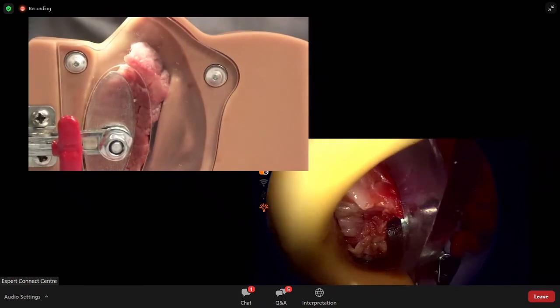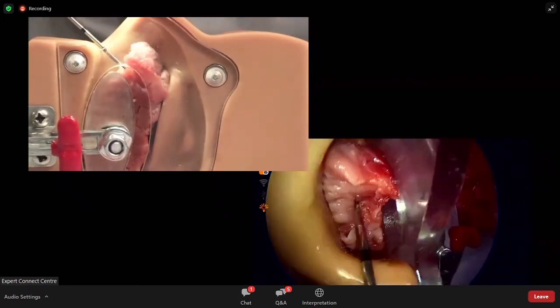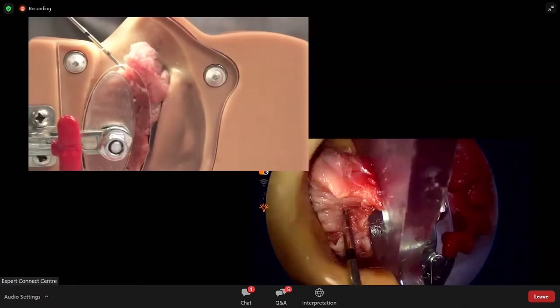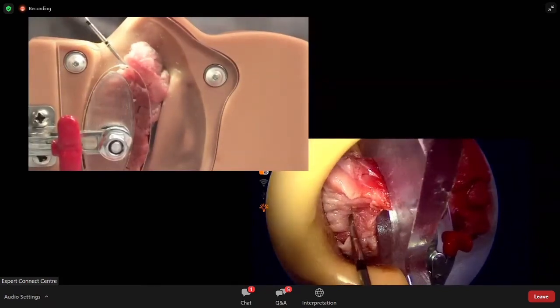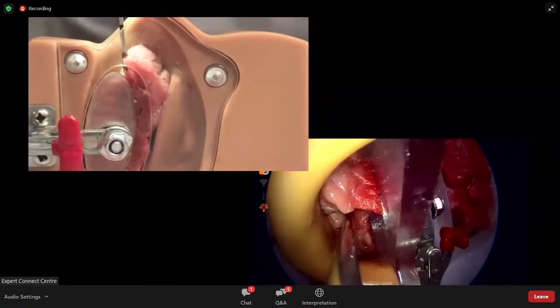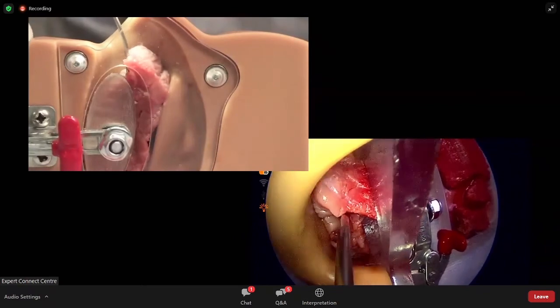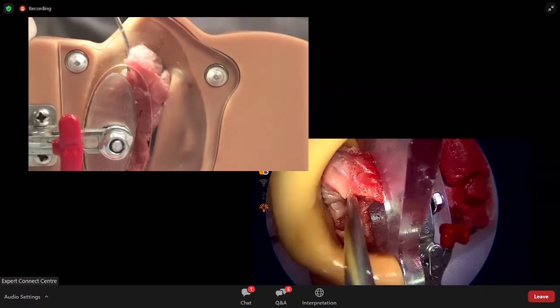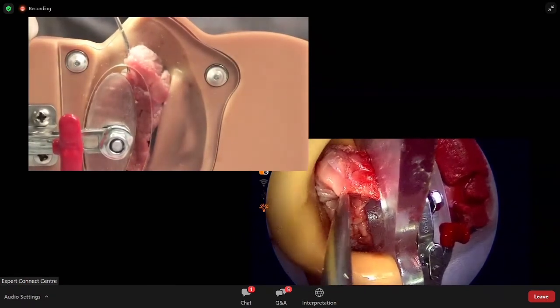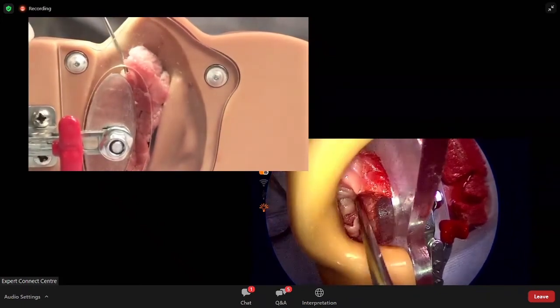But that gives you an opportunity that when you start, you can always coagulate this area here just to stop the bleeding. And then you insert based on the depth indicator. And then you can also check endoscopically. And again, you ought to be checking whether you've perforated mucosa. And if you have, remind yourself to coagulate.